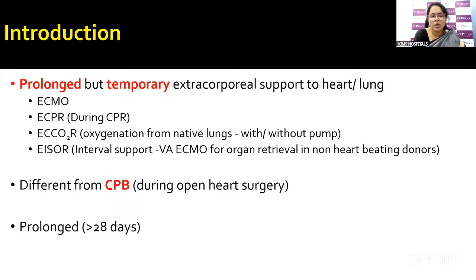There are various terminologies. ECMO, as you know, is extracorporeal membrane oxygenation. When a patient who is in severe cardiopulmonary instability requires ECMO, we also refer to this as eCPR, extracorporeal cardiopulmonary resuscitation. So the patient is initiated on ECMO while receiving CPR. We also have a term called ECCO2R, which is extracorporeal carbon dioxide removal.